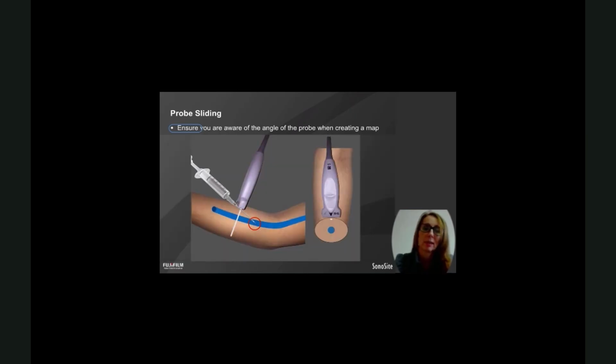That's a very common error. I've seen that a lot, where the staff member is saying to me, but it's not in the vessel yet, and the patient's going, ow, ow. And when you move and tilt it correctly, you realise that they've gone and they're actually poking it back out the other side, down on the bottom. So you can see here now the change in the tilt has got it in the correct place.